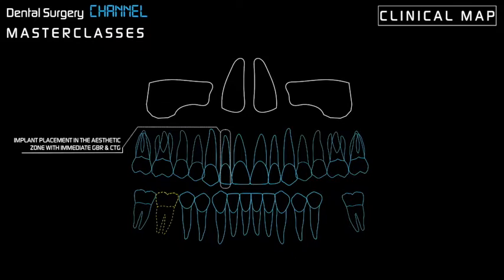You all know how important it is to prepare the soft tissues whenever we are doing an implant case in the anterior area. So it's not only about the bone and the tone that it sets, but also the tone that is set by the soft tissues.